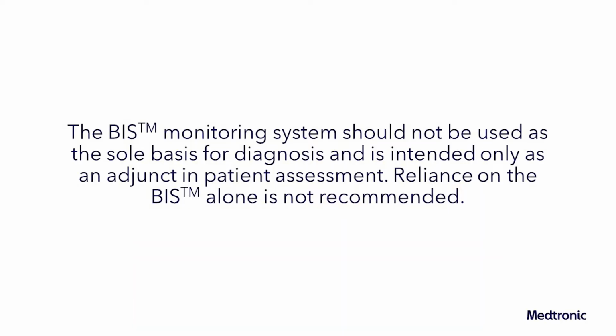The BIS monitoring system should not be used as the sole basis for diagnosis or therapy and is intended only as an adjunct in patient assessment. Reliance on BIS system alone for intraoperative anesthetic management is not recommended.